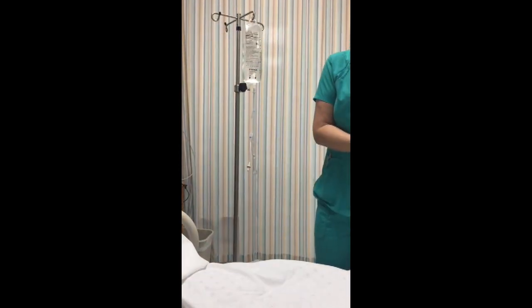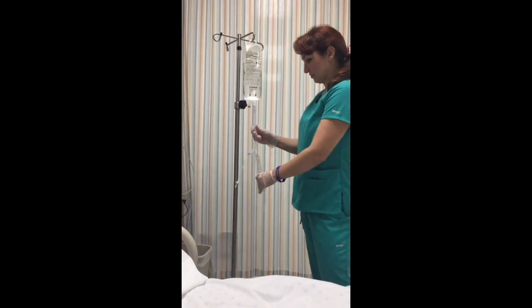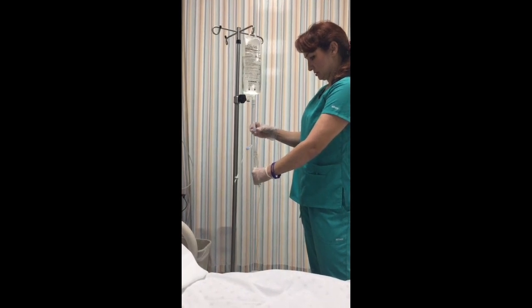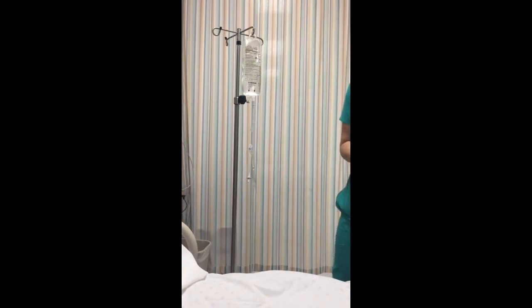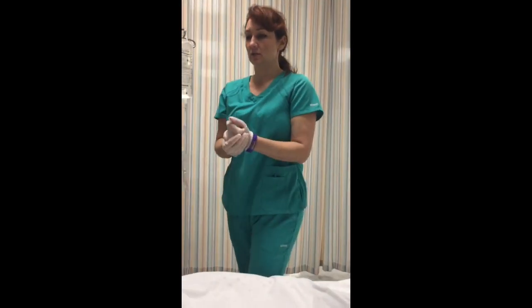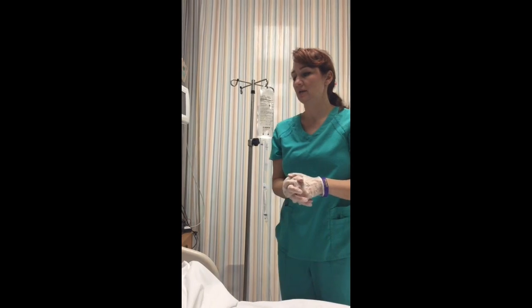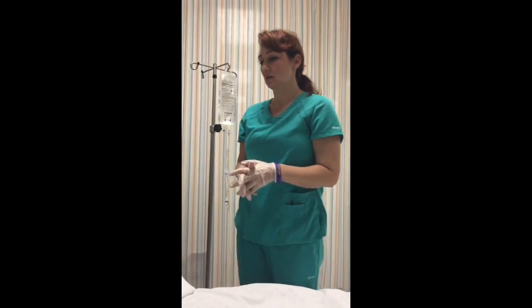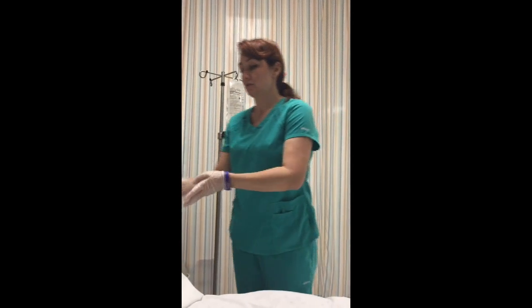We're going to go ahead and prime this — open it up and get some fluids in here, just like you learned in the IV lab. I'm going to get another nurse to come verify all the information with me. Since there's a risk of reaction anytime you get blood, the physician has ordered Tylenol and Benadryl to give you 30 minutes prior to the infusion, so I'm going to go ahead and give those to you now.